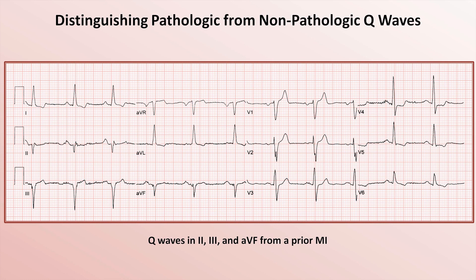The Q-wave in AVF is of slightly different morphology, as it is arguably either a notched Q-wave or actually a tiny Q followed by a tiny R followed by a large S. Even if the actual Q component of the overall QRS complex in this lead were very small, it would still be appropriate to consider it pathologic, given both its context within its own QRS complex as well as its context within the other inferior leads.